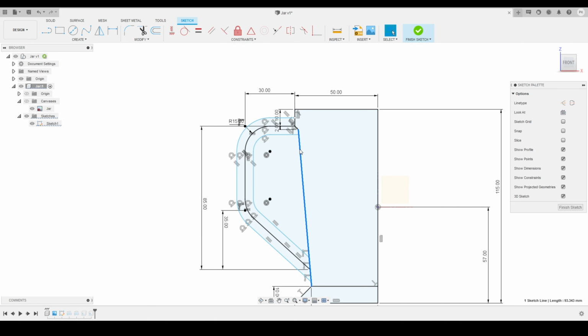And next thing, I will just select these profiles, the edge of our jar, and I'm going to offset these complete profiles by 5 millimeter towards inward. So I will just specify 5 over here. Here you can see I will just specify 5. I don't want to make it 1. So I will press enter. Here you can see I had offset it.